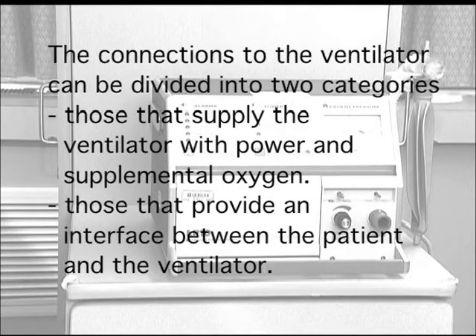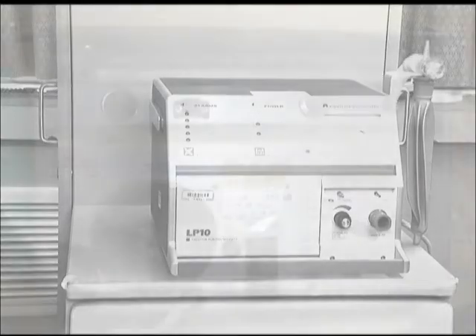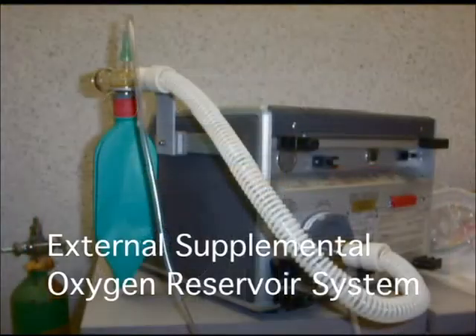The connections to the ventilator can be divided into two categories: those that supply the ventilator with power and supplemental oxygen, and those that provide an interface between the patient and the ventilator. The external connections that provide oxygen and power to this ventilator are the power cord and the external supplemental oxygen reservoir system.